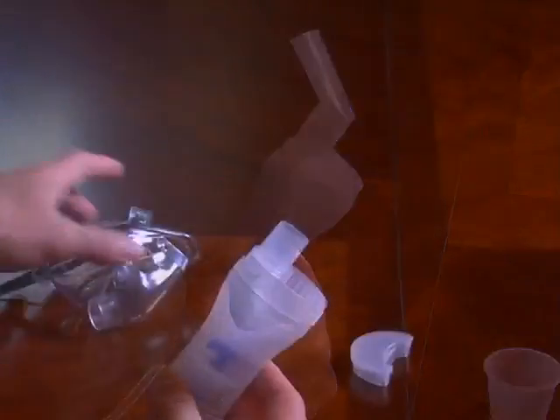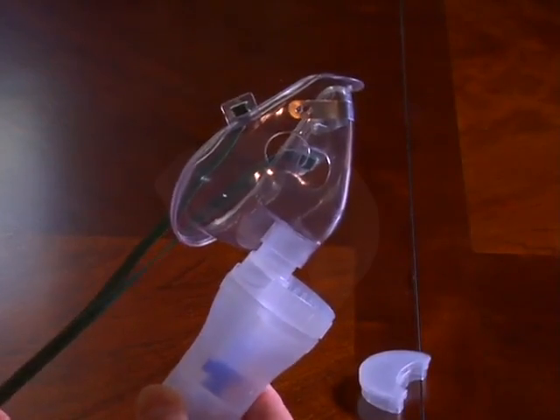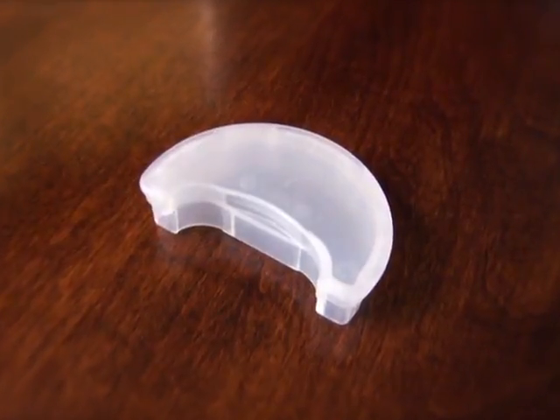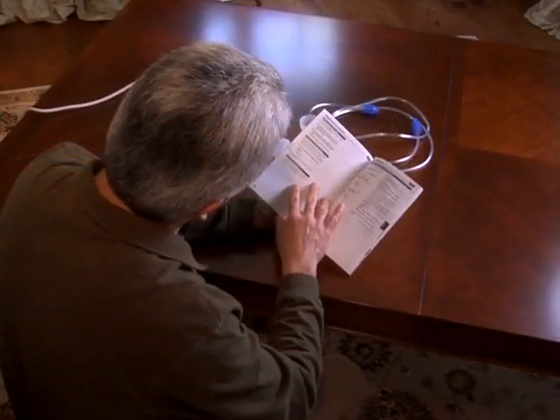If you are going to use the child mask, simply attach the mask to the inhalation top, but do not attach the cap. Instructions for an optional nosepiece or adult mask are found in the instruction manual.